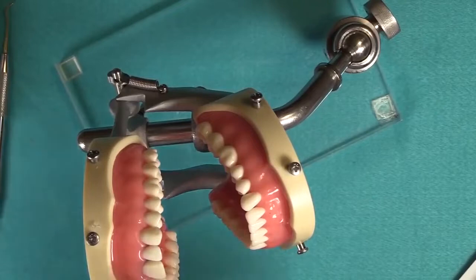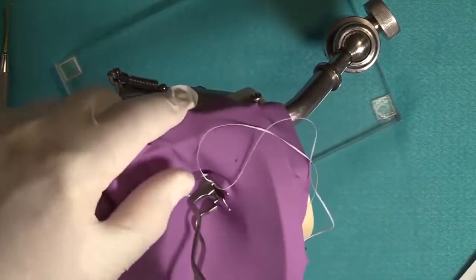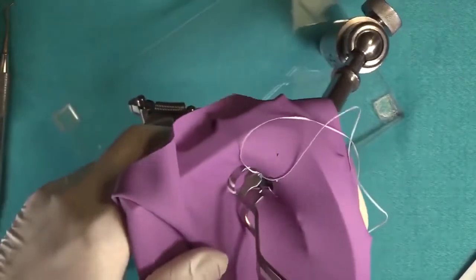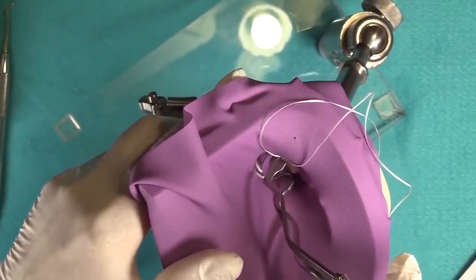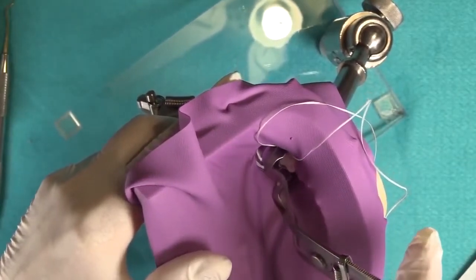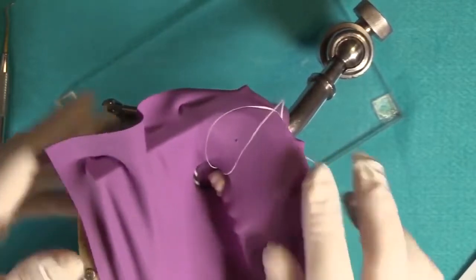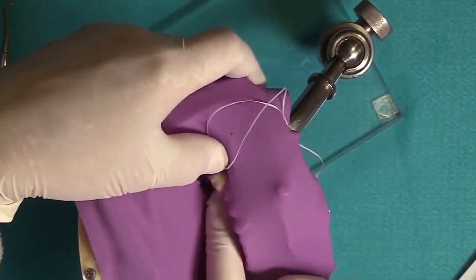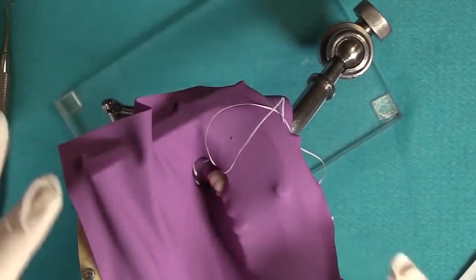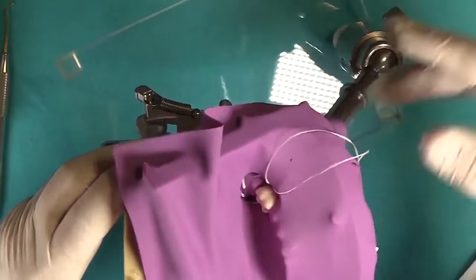Okay. And so when you come into your patient's mouth, you want to come in parallel to the tooth structure. Okay. And then you slide your lingual jaw into position first, and then your buccal jaw. Once your clamp is seated, you check. Put a slight pressure to check to make sure the clamp is thoroughly seated and it's not rocking. So it's stable. That's what you want.